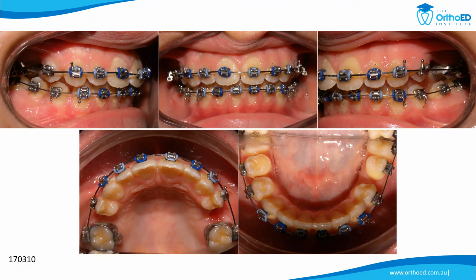Okay, so isn't that going to be too flexible though, to be using elastics to do that amount of movement? Yes and no, but like pulling, overwrapping the 6 and stuff. No. Yeah, look, the overeruption of the 6. Remember I had a transpalatal bar in place at the time.